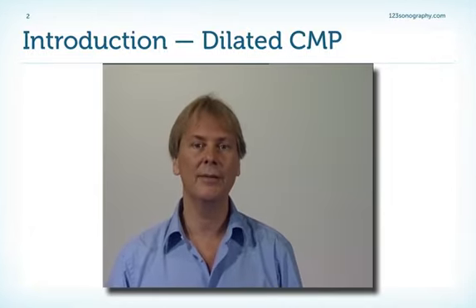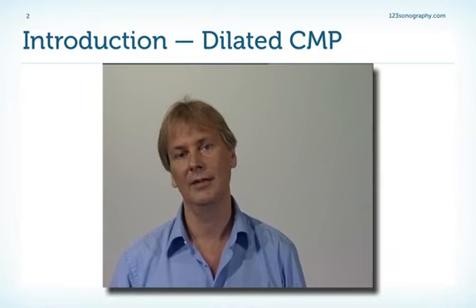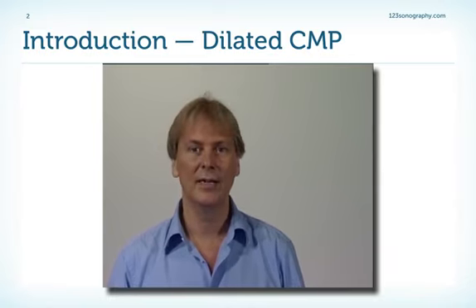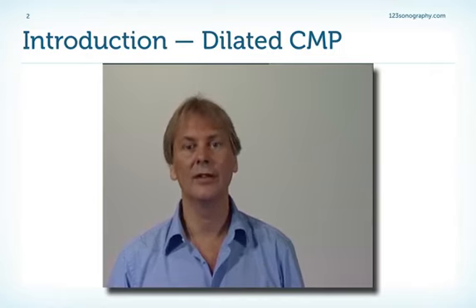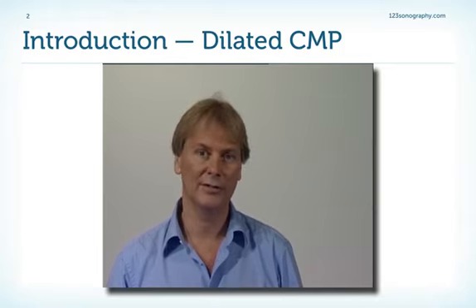Echocardiography is probably the primary imaging tool to assess patients with dilated cardiomyopathy. With help of echo, we can not only establish the diagnosis, we can also assess the prognosis, the hemodynamic sequelae, and very often we can even find out what the cause of dilatation and of reduced left ventricular function is.